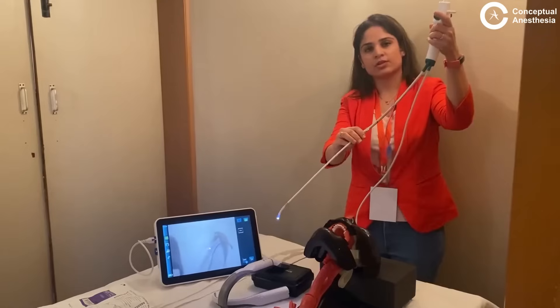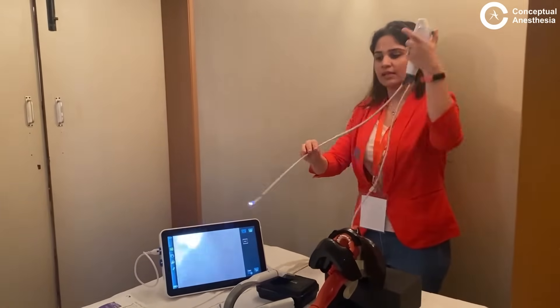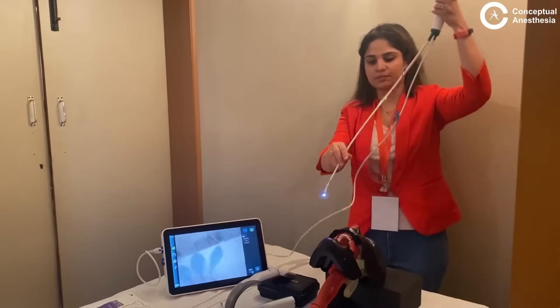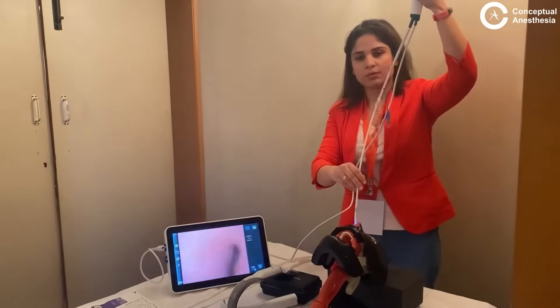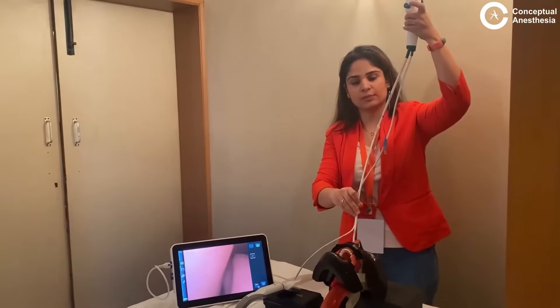This is the button for suction. I keep the angulating lever neutral and the tip neutral. I go in from the nose — this is the most common area from where we enter for fiber optic intubation.